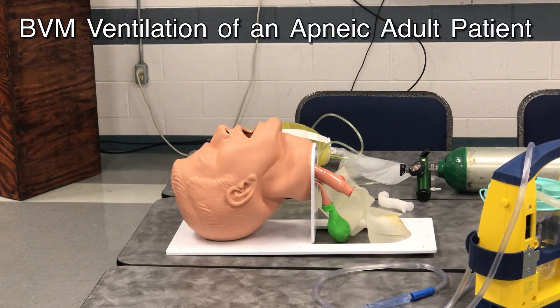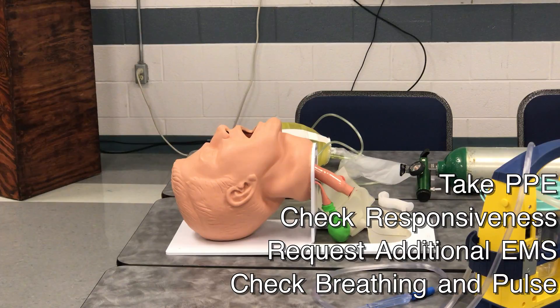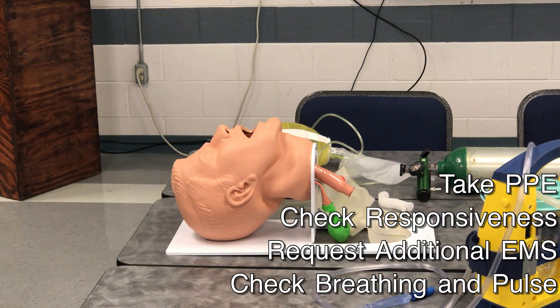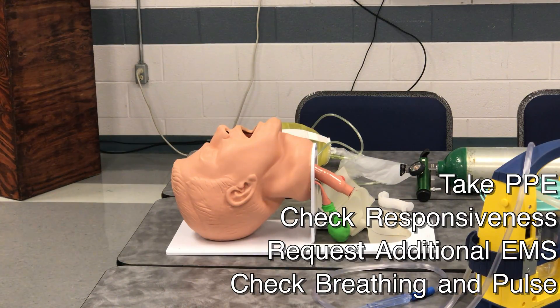Ventilation of an apnea patient. I have my gloves, proper PPE, including face shield or goggles.